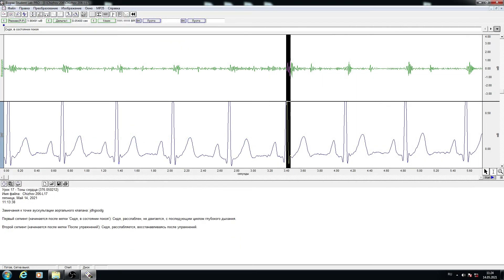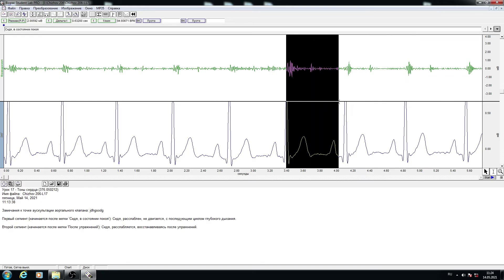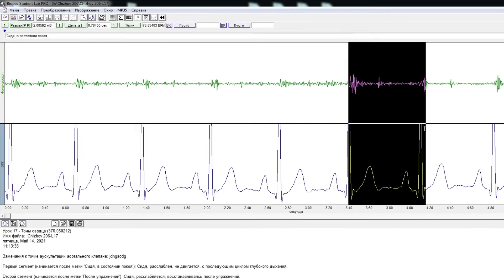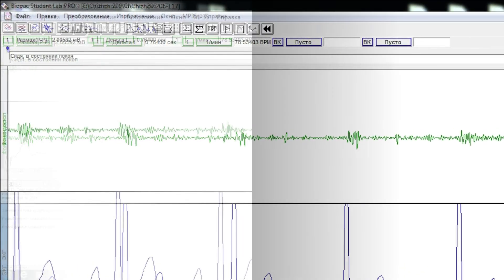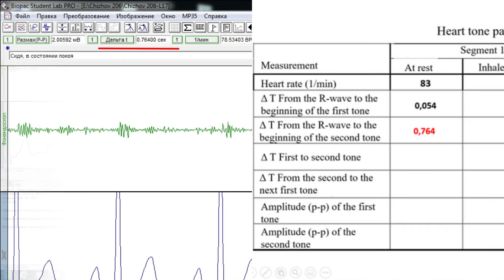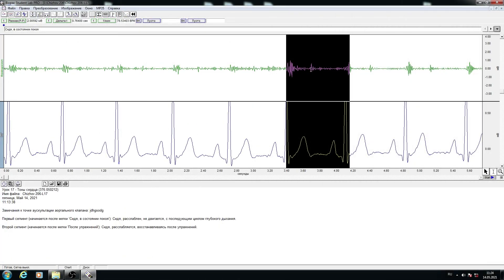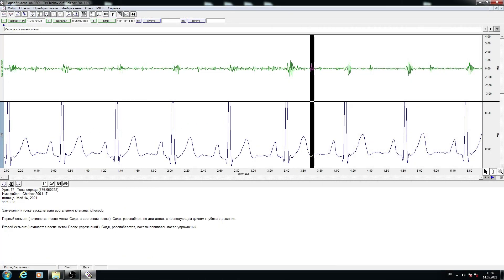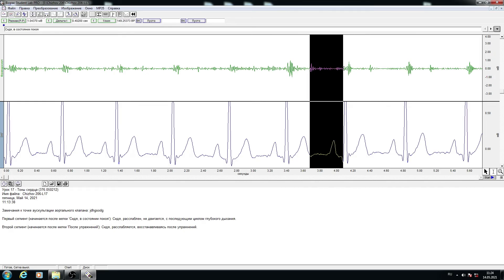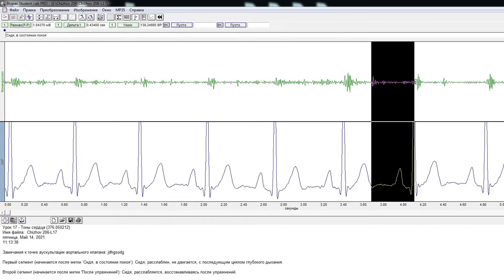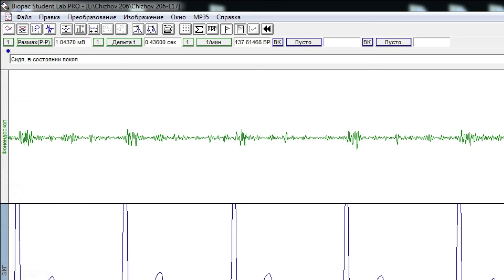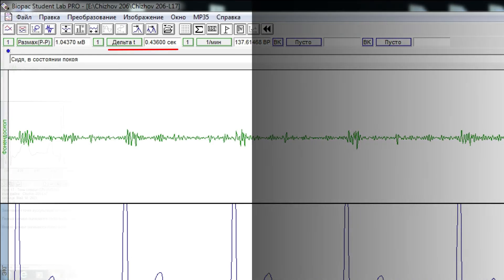Using the i-beam cursor, select the area from the beginning of one R wave to the first heart tone and pay attention to the delta time. Enter the data into the table. Then select the area from the beginning of the second heartbeat to the beginning of the first tone of the next cycle, pay attention to the delta time, and enter the data in the table.